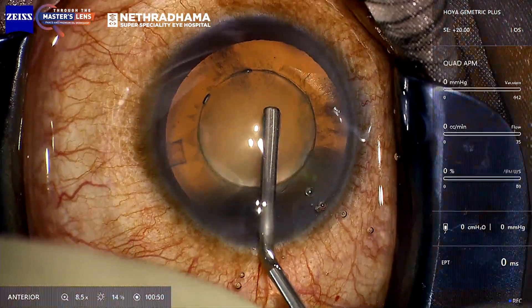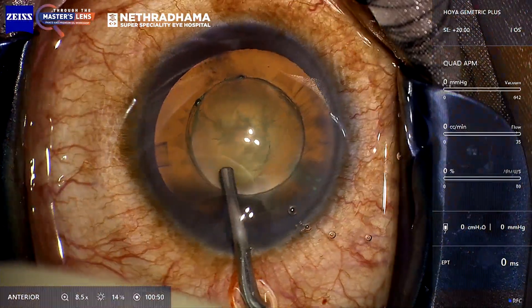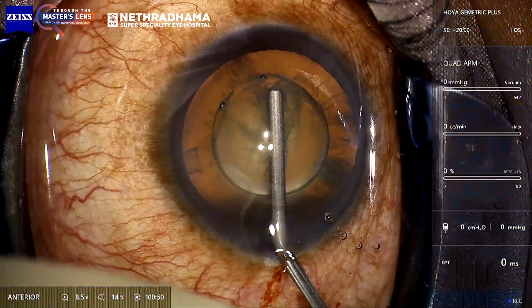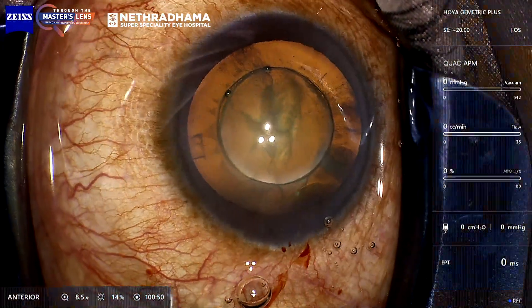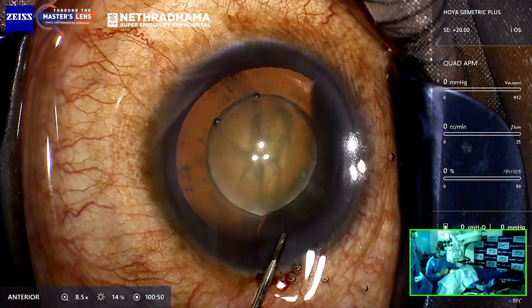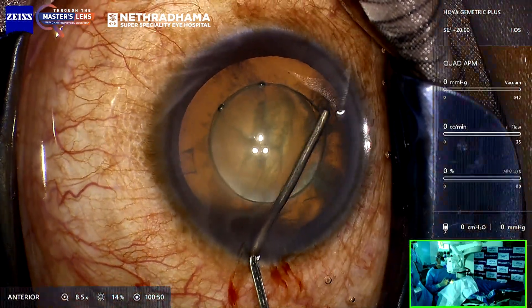I put in viscoelastic and then depress in the center — that releases the sides. You can see the sides are released. As you push in, it creates a vacuum and you can just pull out the rhexis. I don't use forceps. My principle is economy of movements.